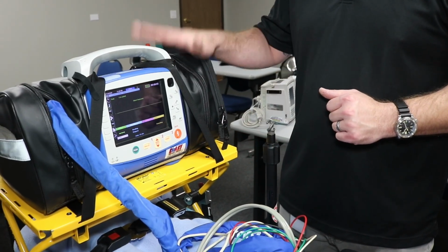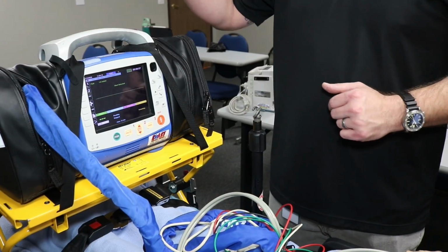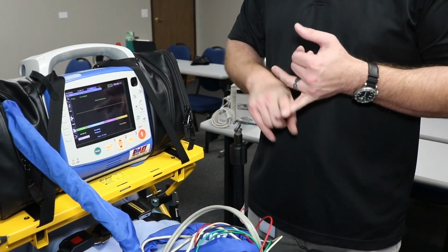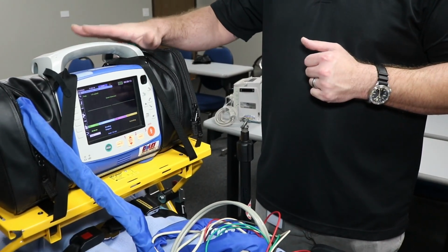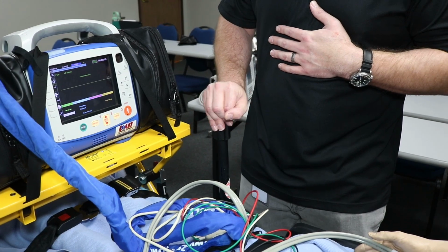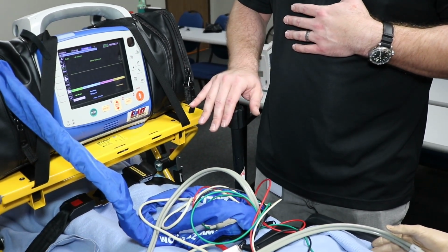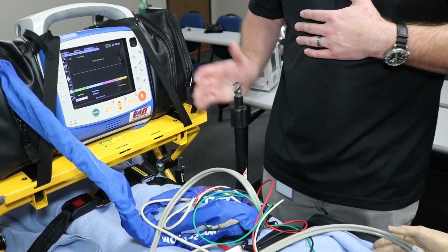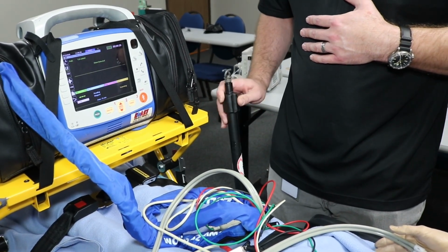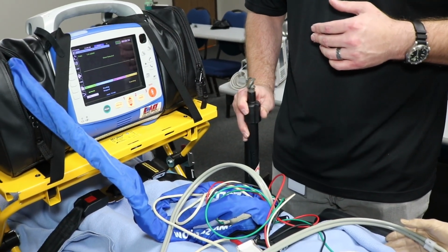We can position the monitor in the back and put the IV pump on the tray as well as, like I said, our ventilator or our Airvo. We can always utilize the tray for that as well. But for the pump, we're going to go over how to mount it here and tighten it all down so that it doesn't fall on the patient. Again, it's in the up position. We want to give it a little jiggle, make sure that it is not going to fall on the patient. Make sure it is all the way down into that position.